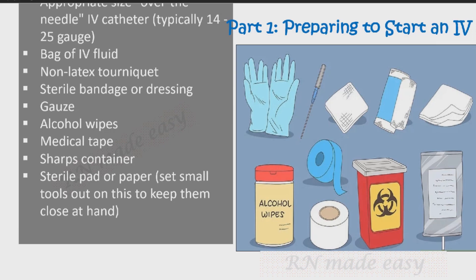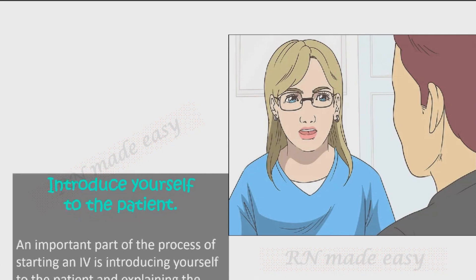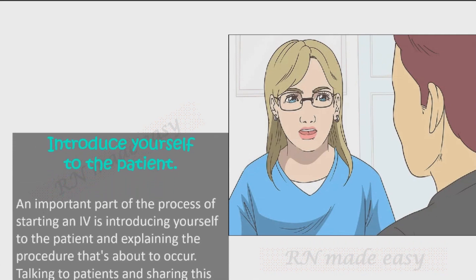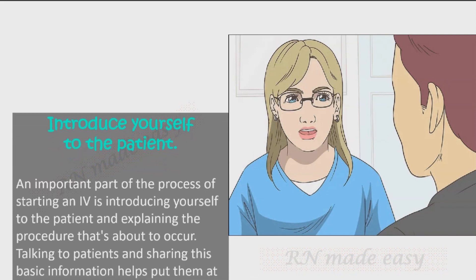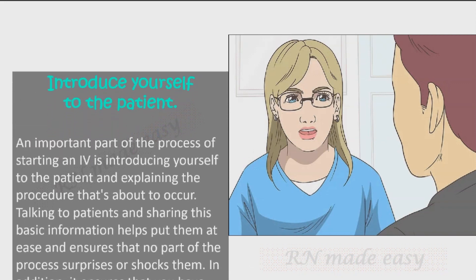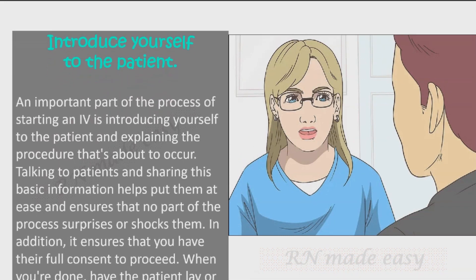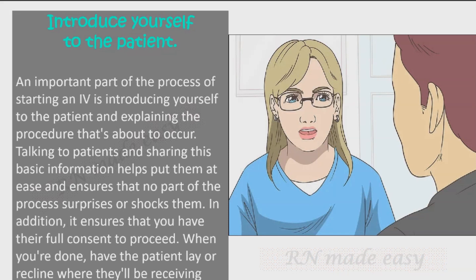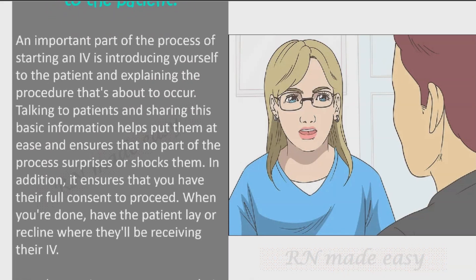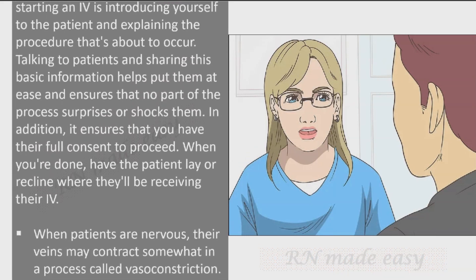Introduce yourself to the patient. An important part of starting an IV is introducing yourself and explaining the procedure that's about to occur. Talking to patients and sharing this basic information helps put them at ease, ensures that no part of the process surprises them, and confirms their full consent to proceed. When done, have the patient lay or recline where they'll be receiving their IV.